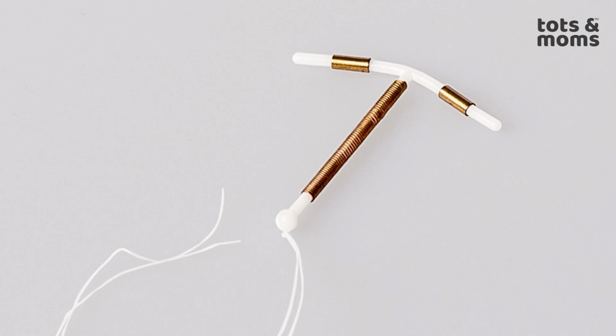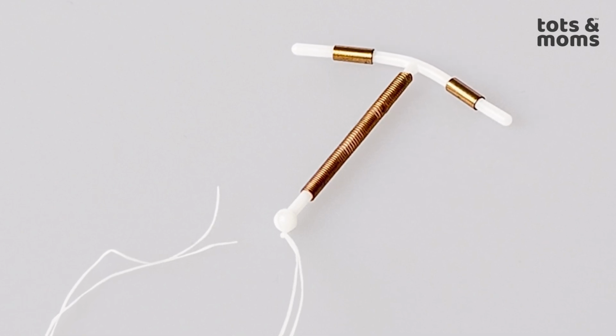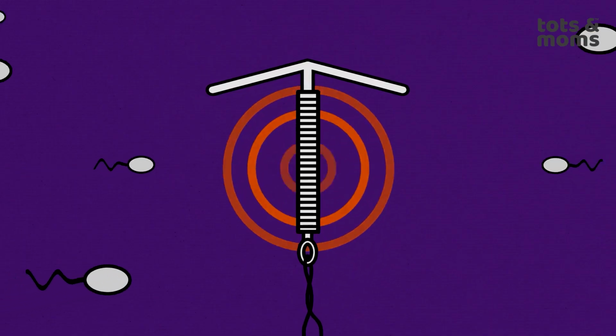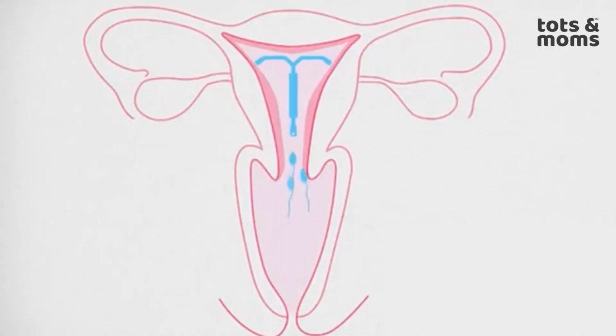Types of IUDs: the most famous and common one is copper T. This is a T-shaped device again, with copper wire rolled around it on both sides. This copper T releases copper ions inside the uterine area, acting as a spermicide and preventing fertilization. So in simple words, this blocks the uterus, and hence the sperms cannot enter to get fertilized. This has a life of 5 to 10 years, depending on the brand.